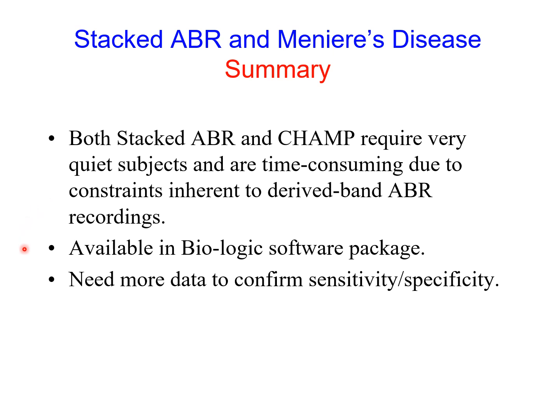The CHAMP is available in the Biologic software package. However, we will need more data to confirm sensitivity and specificity outcomes for using CHAMP to help diagnose Meniere's disease. So this is the summary and the information I want to go over in terms of stacked ABR and Meniere's disease.